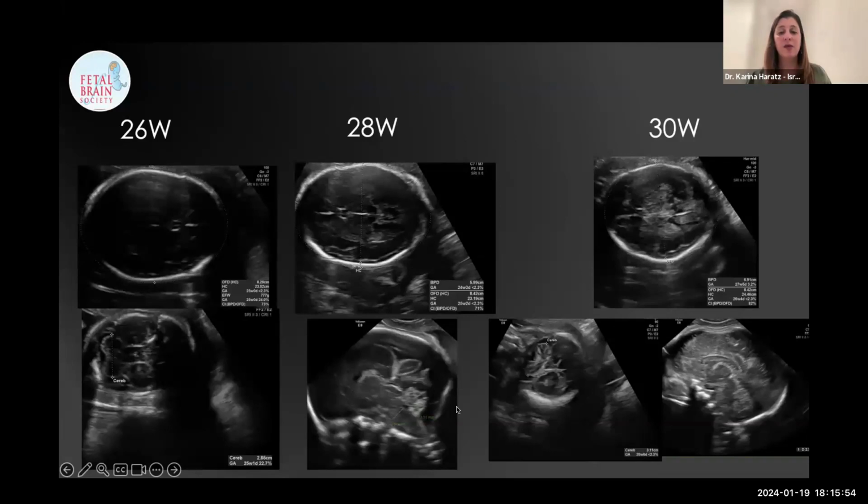But then we have, and this is a post-processing evaluation after we had the diagnosis, and if we check on the morphology of the brainstem and the cerebellum, it's quite kept. Okay, we see the belly of the pons, we see the vermis quite hyperechogenic compared to the pons. We don't see an irregular posterior aspect of the brainstem, nothing, but the biometry is small.